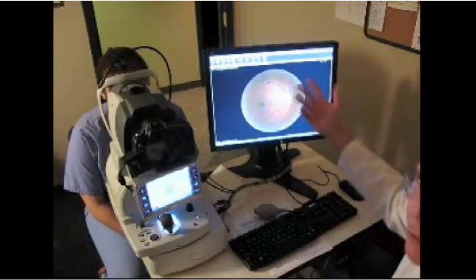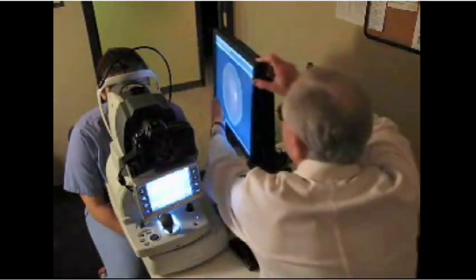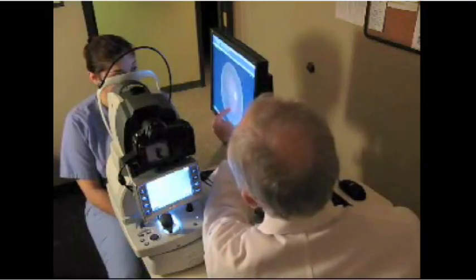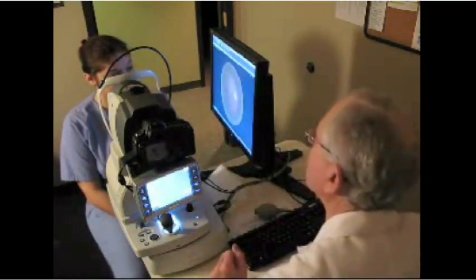Now, what I do when I'm screening for diabetics is that I just rotate the screen around like this. And Judy, you can sit back. And if you look here at the screen, you can see that your nerve is here, your blood vessels are very healthy, this is the center of your retina — the macula — perfectly normal examination.